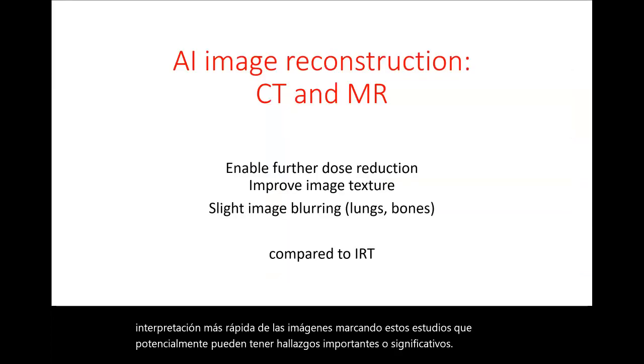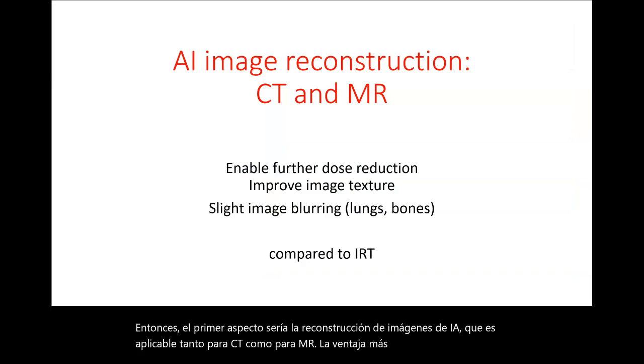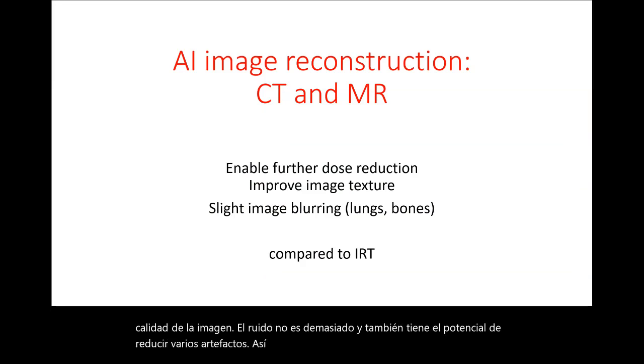So the first aspect would be AI image reconstruction, which is applicable both for CT and for MR. The most important advantage of this AI-based image reconstruction is reduced radiation dose without significantly compromising image quality. The noise is not too much, and it also has the potential to reduce various artifacts. So this is in comparison to iterative reconstruction techniques.